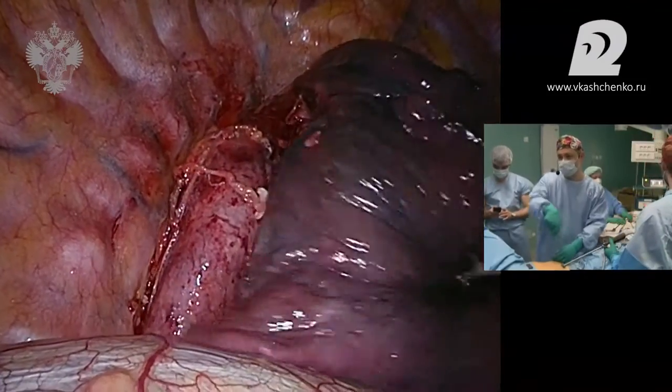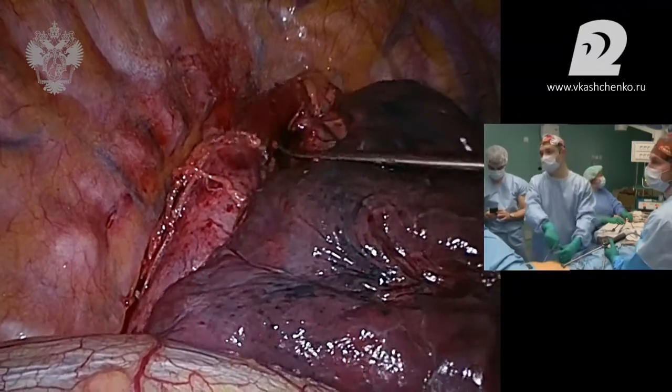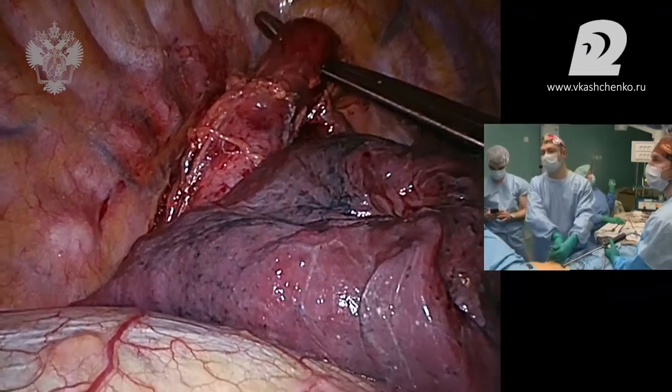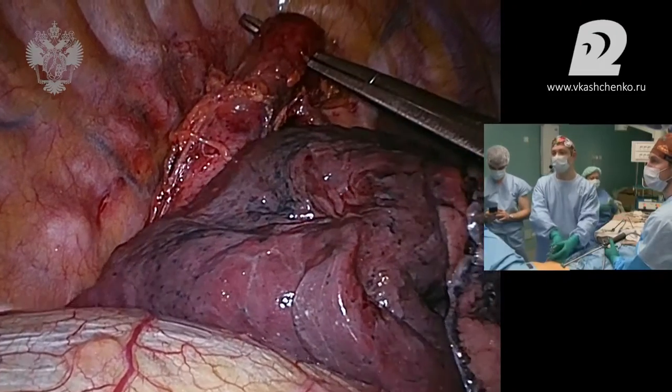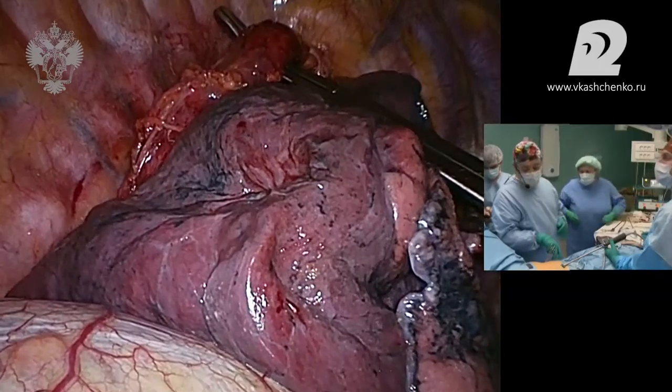В принципе, вы видите, мы готовы к пересечению пищевода. Примерно вот на этом уровне мы его пересечем. Вы видите, достаточно далеко от опухоли, а потом мы досечем еще участок, когда будем извлекать пищевод на шею.